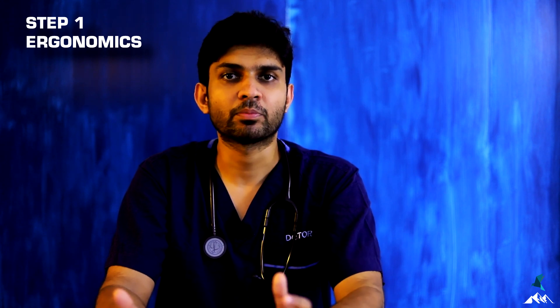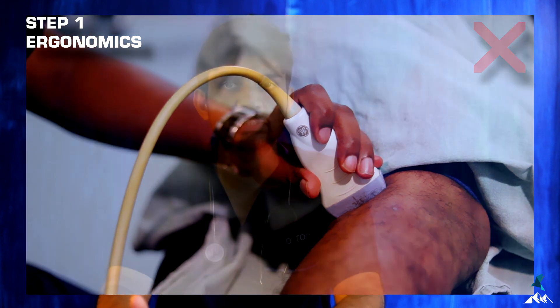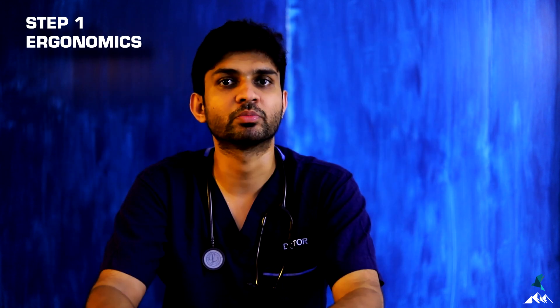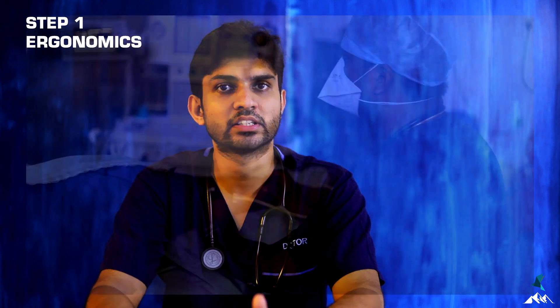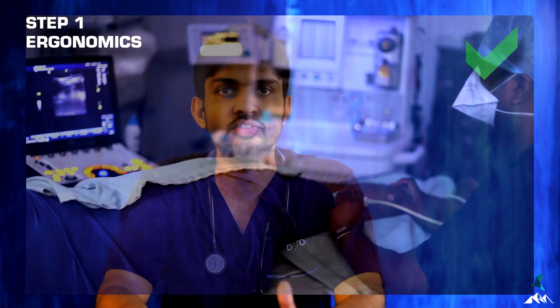After keeping the hand in a proper position, next is how to hold the probe. Hold the probe in a more distal position so that you get fine movements. Never hold the probe with pressure because with jelly this leads to jerky movements. Always try to change the position of the patient so you can do the procedure comfortably — that will benefit the patient.